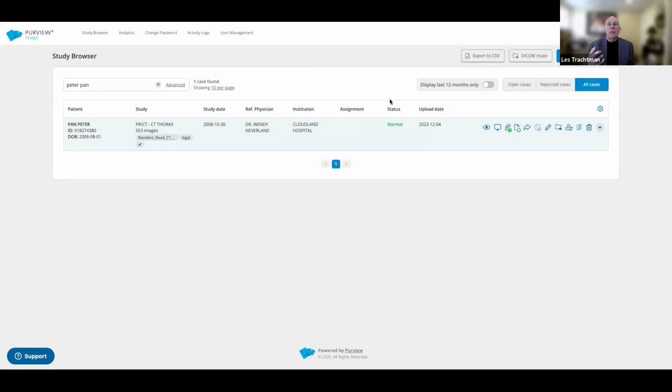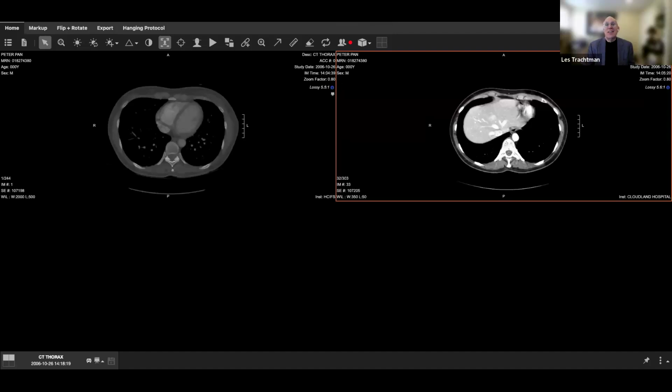So if I'm going to describe it to you, I can describe it to you exactly the way you see it and perceive it. But there's even better, which is that you can do it with me in real time. That's right. We can take it a step further, and we can look at this, like Les was alluding to, at the exact same time.